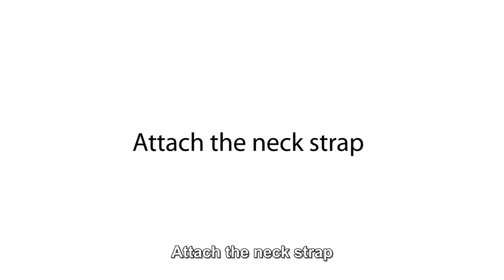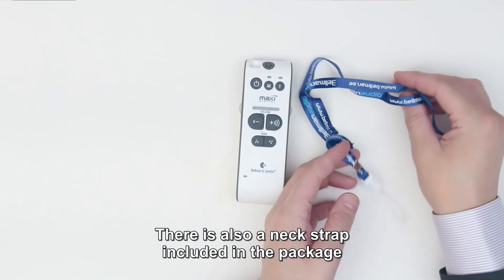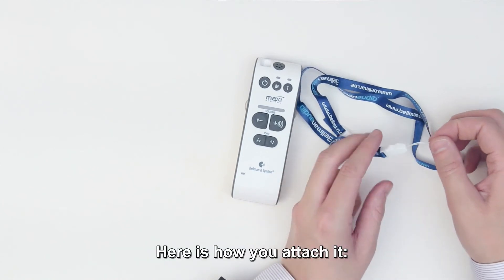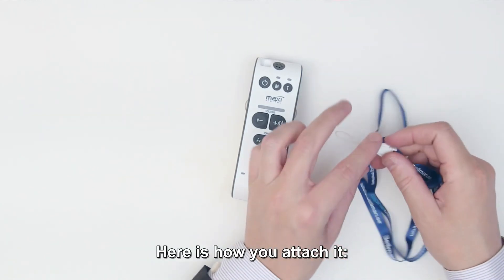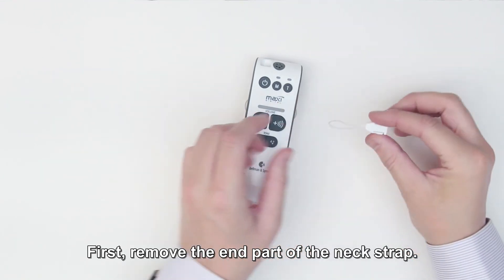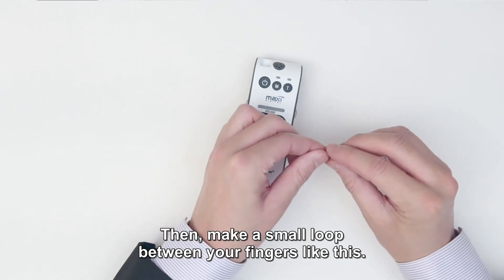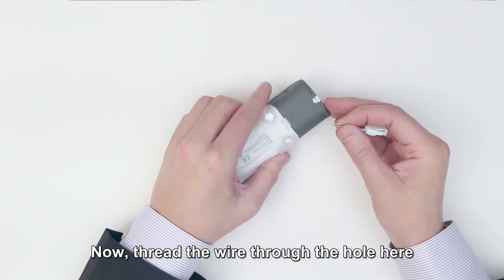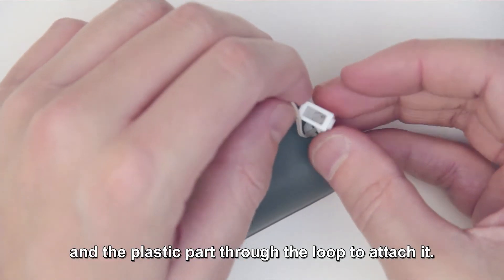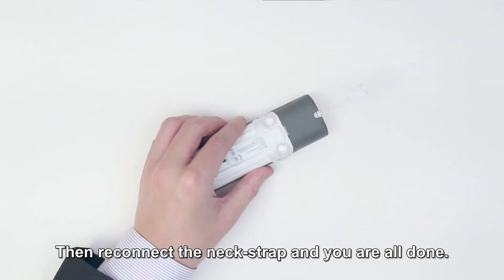Attach the neck strap. There is also a neck strap included in the package if you prefer to wear Maxi around your neck. Here is how you attach it: first remove the end part of the neck strap. Then make a small loop between your fingers like this. Now thread the wire through the hole here and the plastic part through the loop to attach it. Then reconnect the neck strap and you're all done.